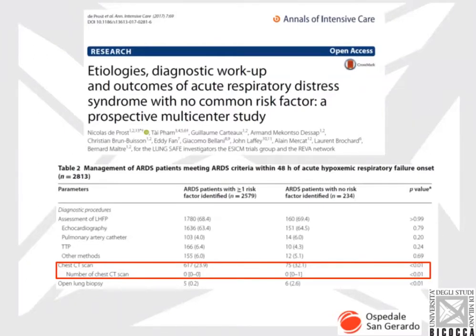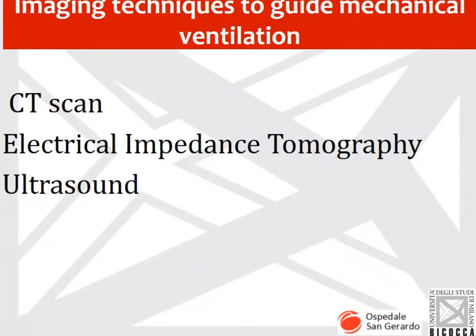This is a secondary analysis of our study where Nicolas Deprost analyzed the data, and he has shown that patients with no risk factors identified for ARDS underwent a CT scan more frequently, in about 32% of cases. So this emphasizes the fact that CT scan has a clear role in clarifying diagnostic doubts we might have.